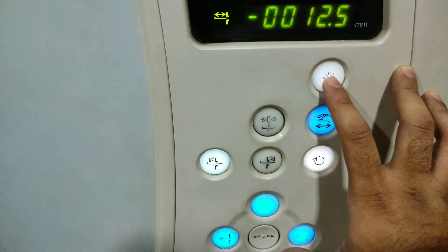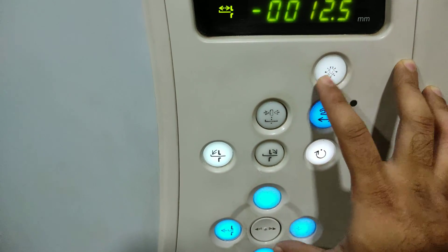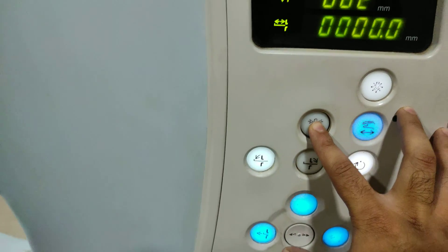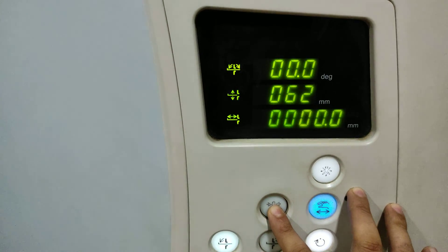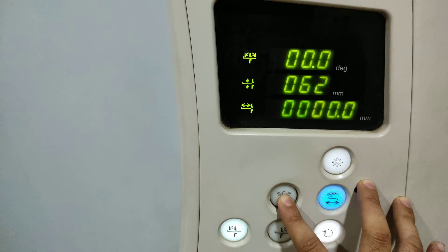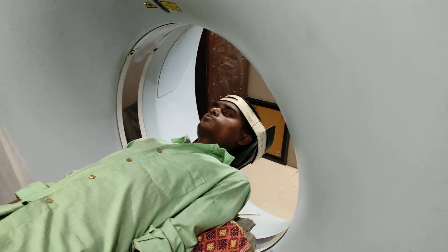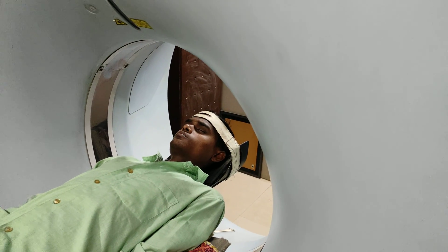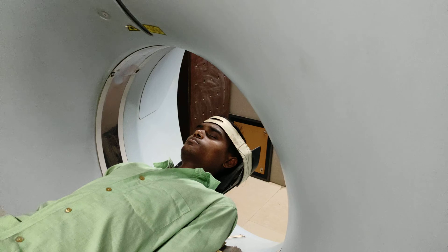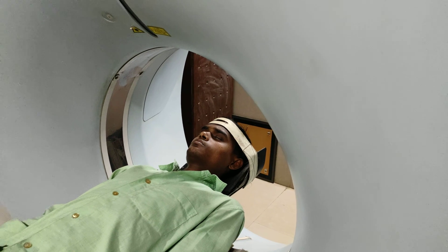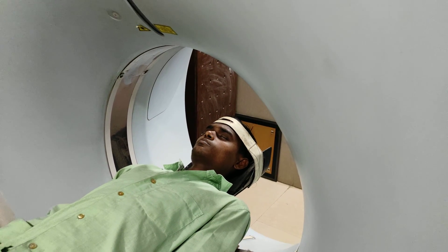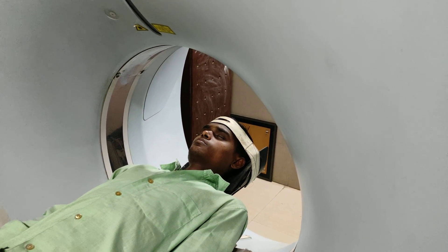Then close the light and set zero — the table position should be zero. This is how you have to give the position for a CT brain scan: landmark on the mandible. Now I will show you on the console how to scan.